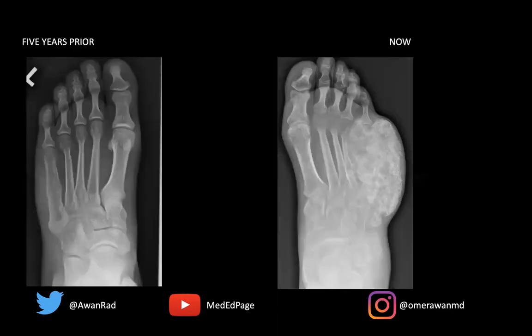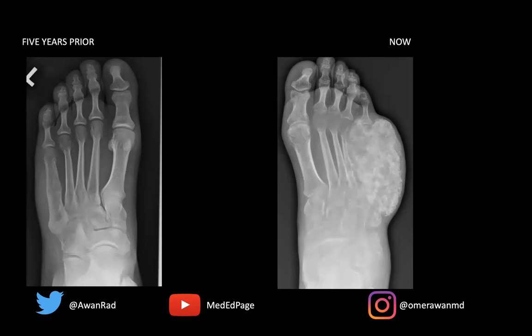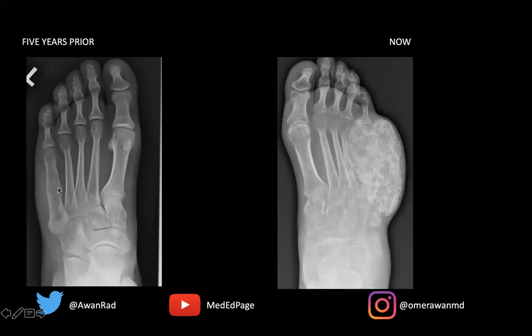Coming back to the image, there is a lesion in the fifth metatarsal. The person who read this study didn't even mention it. Although it's subtle, it's a real finding and it's an aggressive lesion. There's a permeative lytic destructive lesion in the fifth metatarsal. You can appreciate endosteal scalloping of the cortex — we barely see the thickness of the cortex here. We have some lifting of the periosteum and some subtle periosteal reaction.